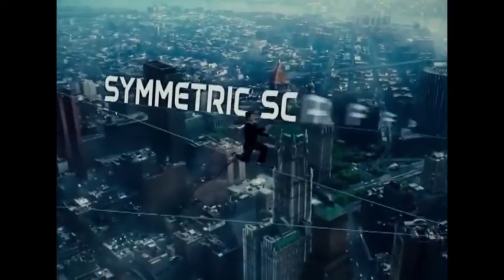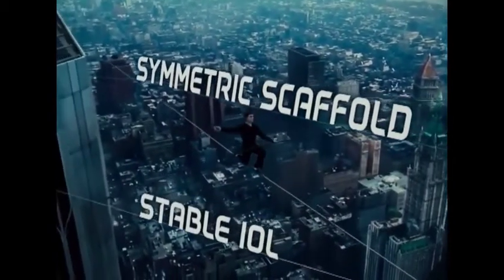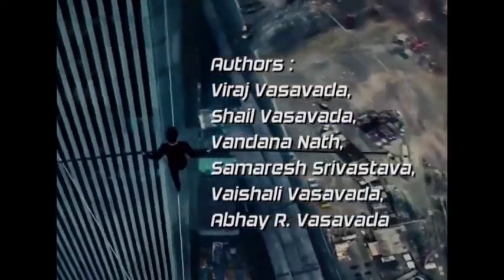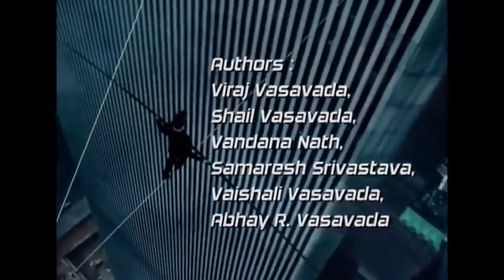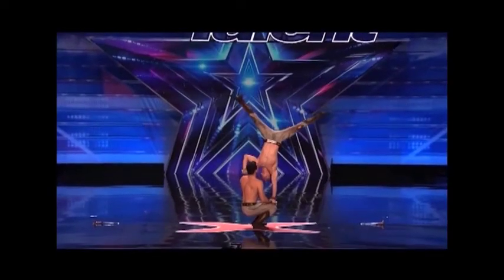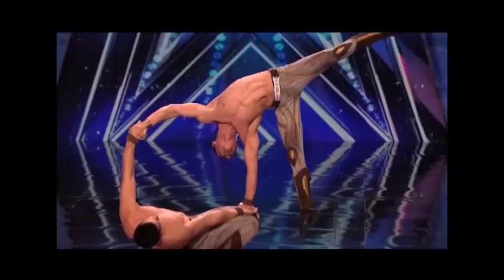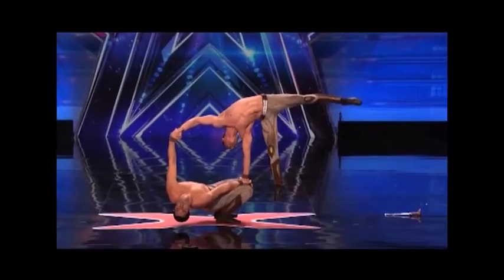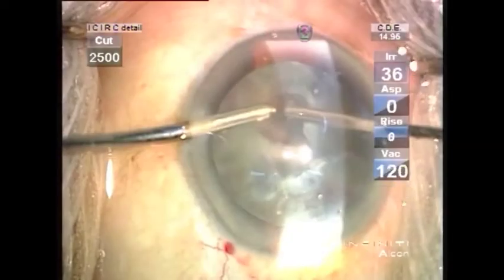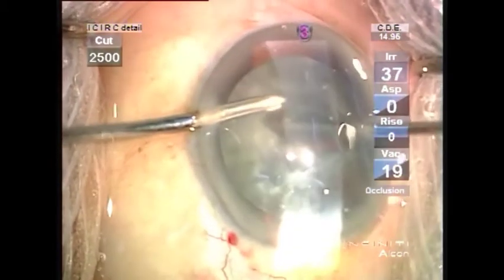Symmetric Scaffold, Stable IOL. Stability is all about achieving the right balance, and balance is all about the perfect symmetry. Managing vitreous prolapse in a posterior capsule rupture is one such situation.